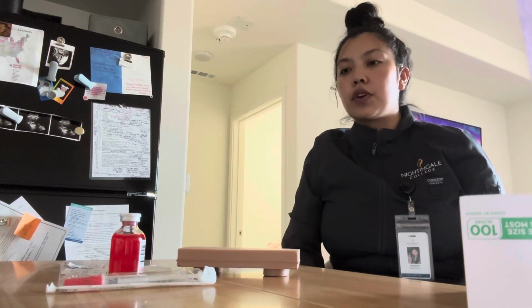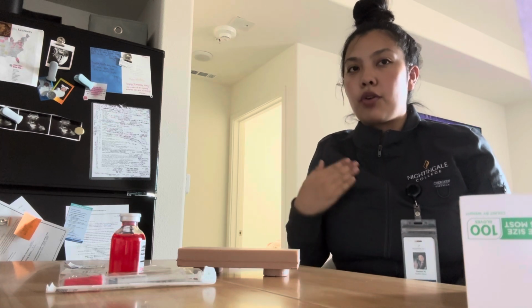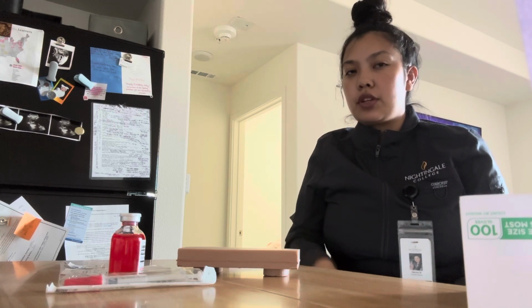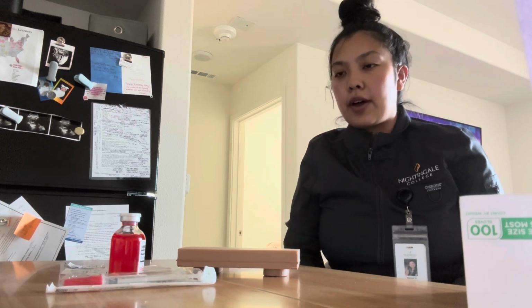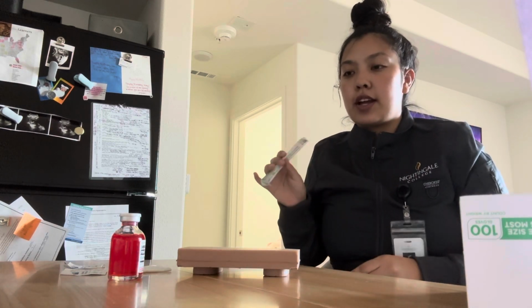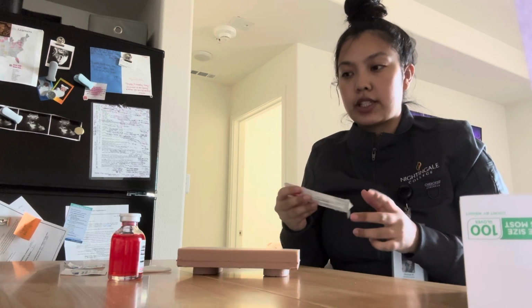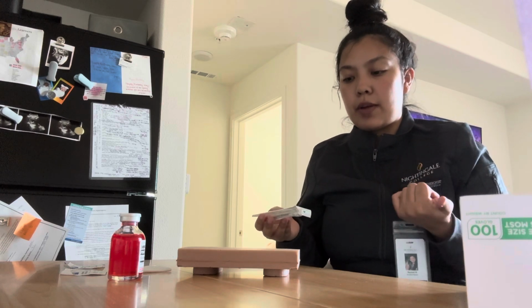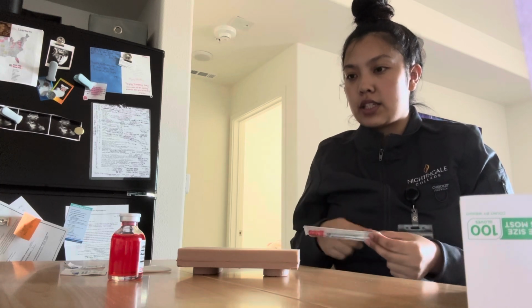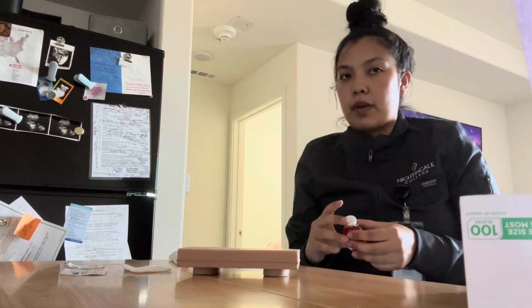Okay, so first things first, I'm gonna collect all of my supplies, and this is gonna be the first time that I check my order. My order reads tuberculin skin test, 5 tuberculin units per 0.1 ml intradermal once. I'm gonna make sure that I get the correct syringe and needle. So the correct needle for this procedure would be a 1 ml 25-27 gauge and 5/8 inches. And then the medication is tuberculin purified protein derivative.